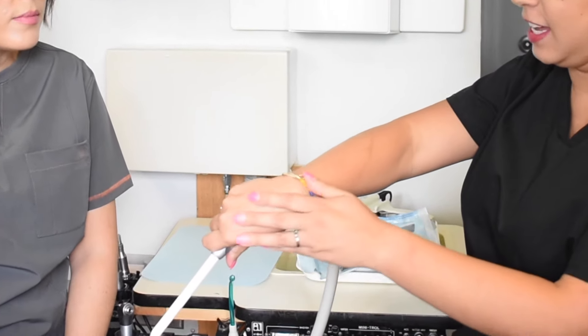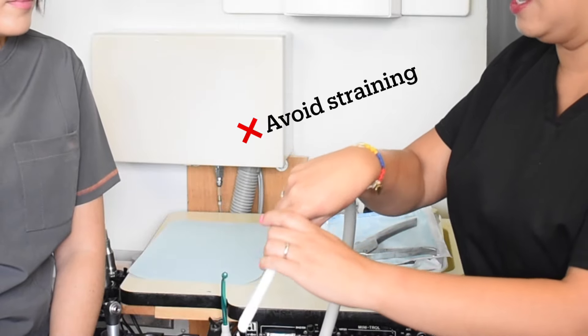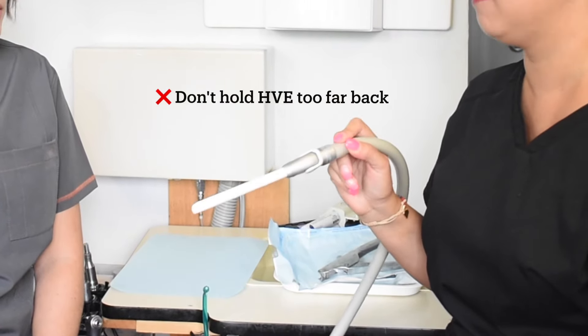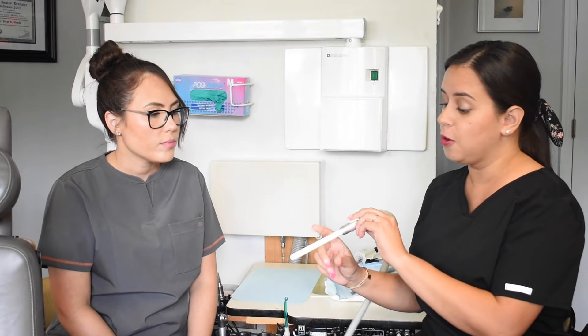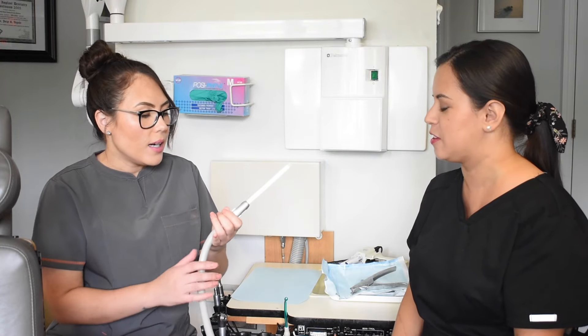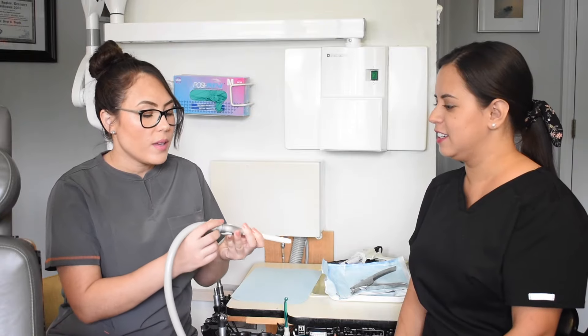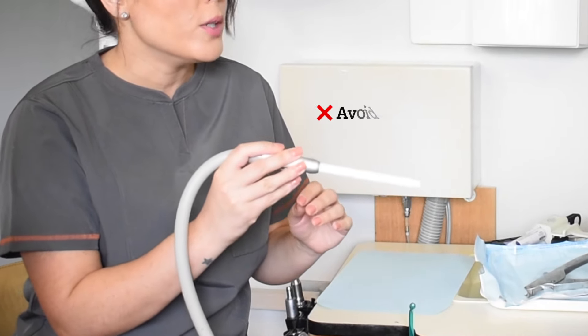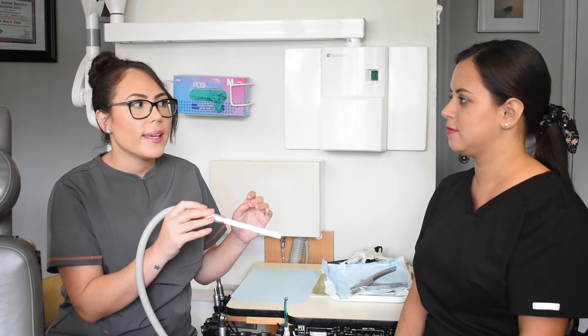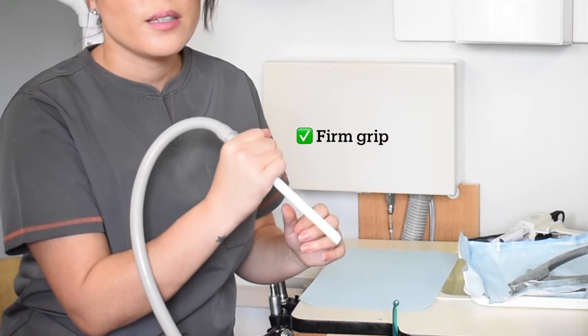If you hold it like this, you feel that tension. If you hold it too far back, you don't have control — you feel how all this weight is just not working. Or if you hold it too far out, that can't work either. If you hold it almost in the middle, you have this pulling your hand down and it's dangling everywhere. Just go right here where you have control.